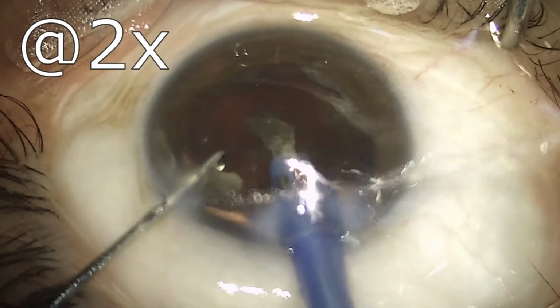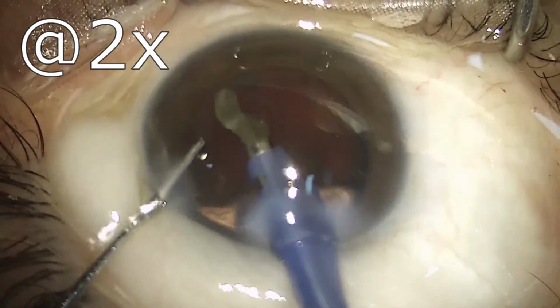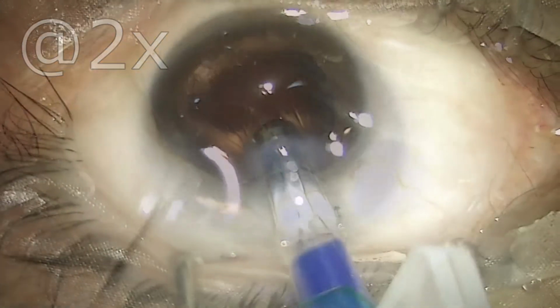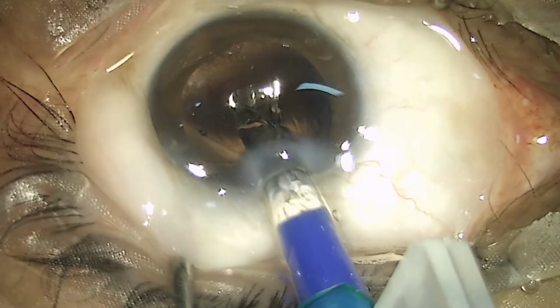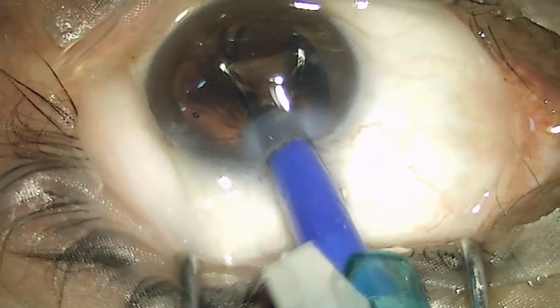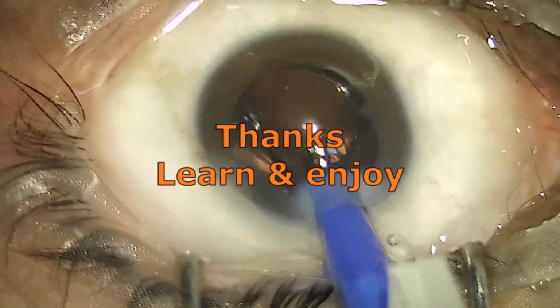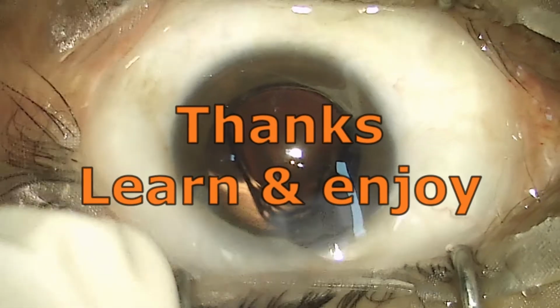Proceeding to IOL implantation, there is hardly any cortex, as is commonly seen in these large dense nuclei. Most of the manipulation which is done during the disassembly and consumption of the nucleus usually results in dislodgement of most of the cortex.